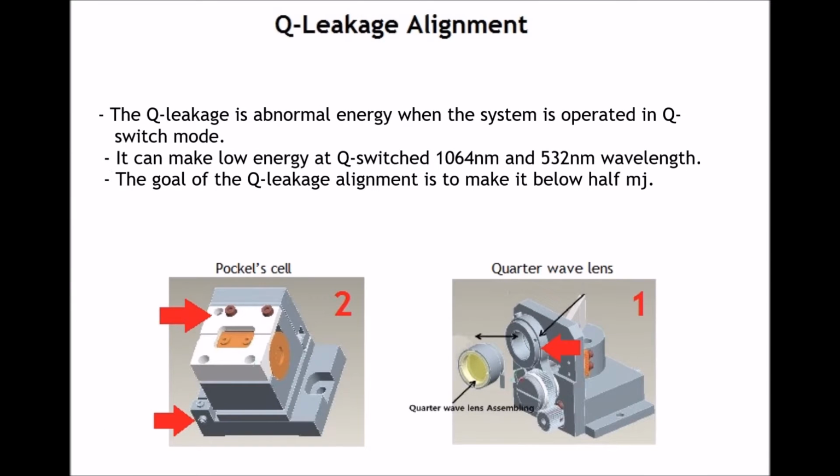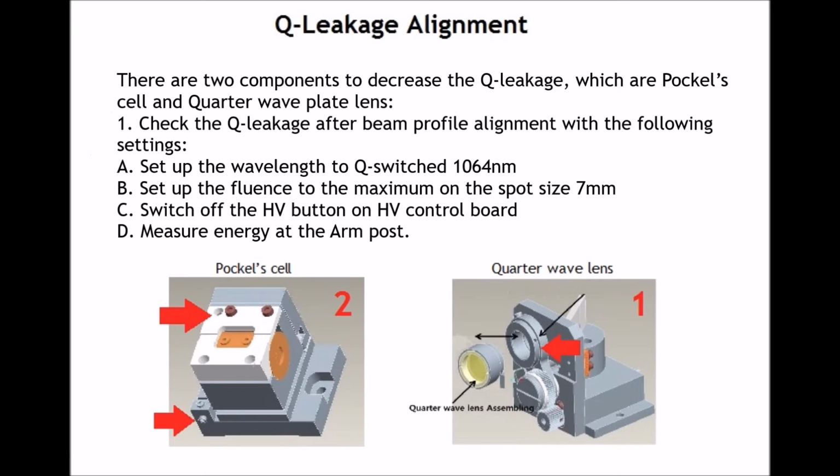Q leakage. The Q leakage is abnormal energy when the system is operated in Q switch mode. It can make low energy at Q switch 1064 nanometer and 532 nanometer wavelength. The goal of the leakage alignment is to make it below half millijoule. There are two components to decrease the Q leakage, which are Pockels cells and quarter wave plate.